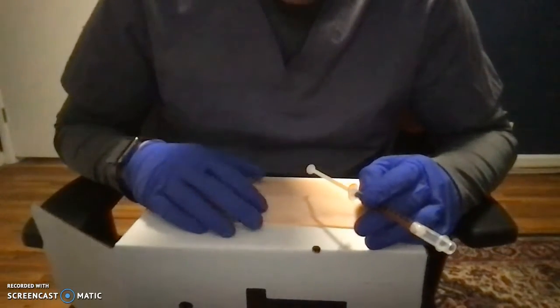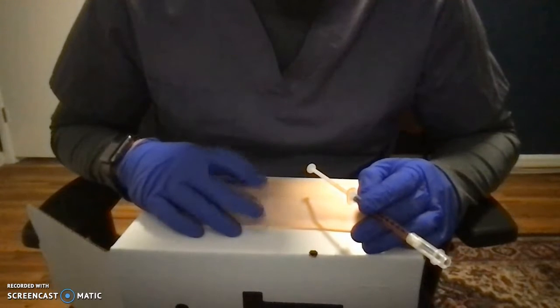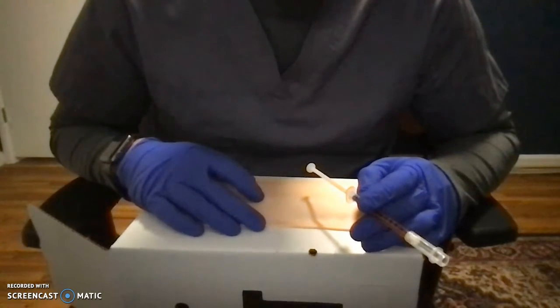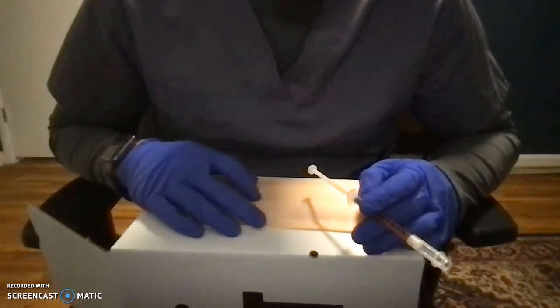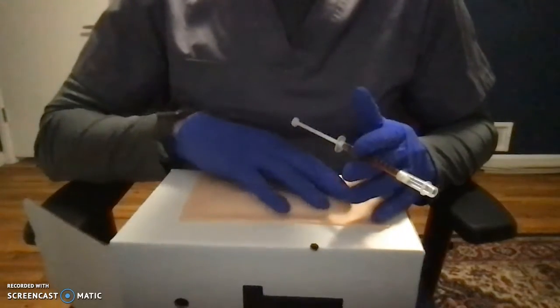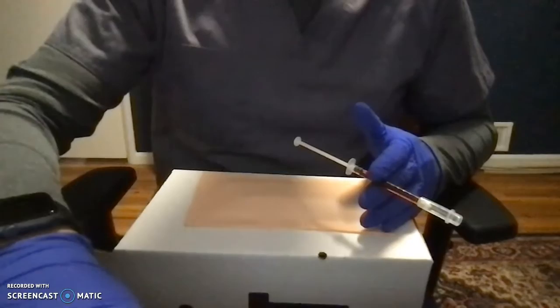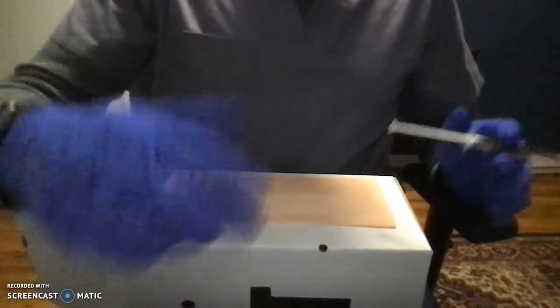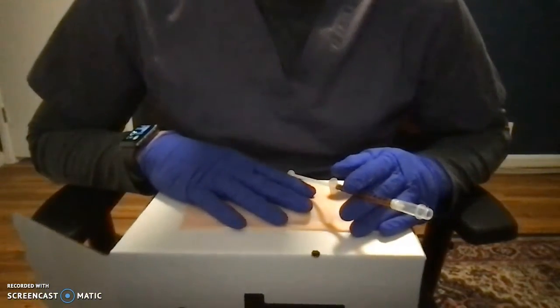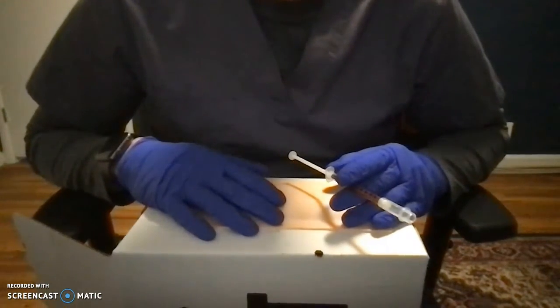So again, checking for any bruises, inflammation, edema, anything like that, and making sure we don't have any of that. We're also going to palpate the site and just make sure there's no masses or tenderness or anything like that in there, and just making sure that the injection site's going to be good to use. If we were doing insulin, we'd want to make sure that we were rotating the sites and stuff like that as well.